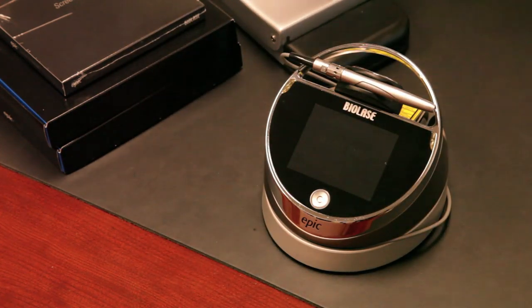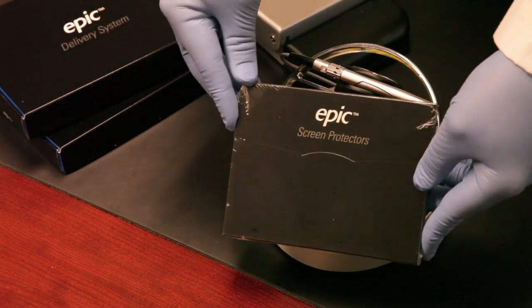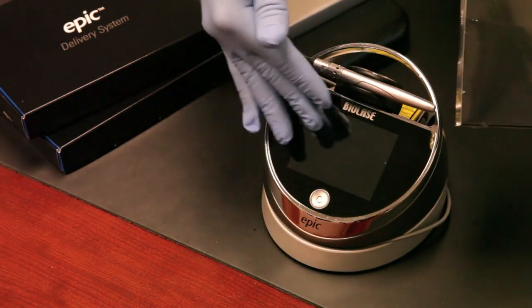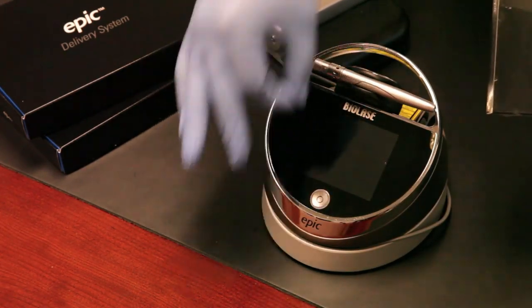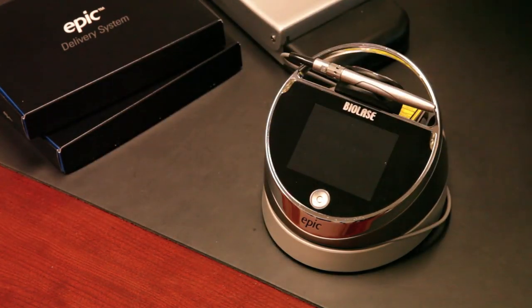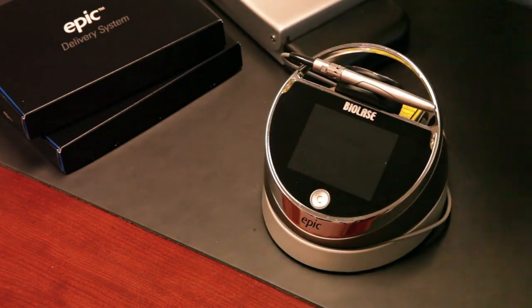With the basic EPIC package, you also receive a box of screen protectors. There are 30 of these in the box. You apply one to the front of the laser, and when you're done with the procedure, you peel it off and throw it away. Simply wipe it down with an alcohol wipe — that's how you clean the front of the laser. We recommend using them with the EPIC.